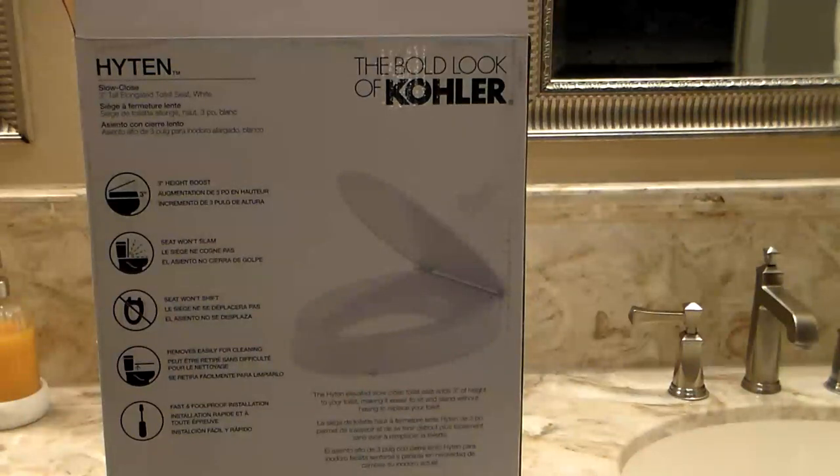This is the toilet seat I selected to install. It's a Kohler brand, the same brand as my toilet, and the box shows a three-inch boost in height. It also has a won't-slam lid, which is a nice feature, and all you need to install this is a screwdriver.